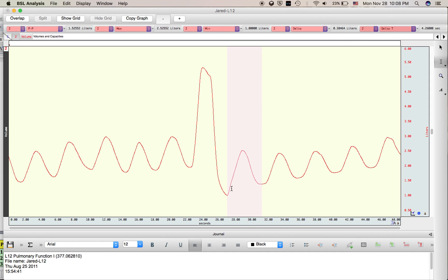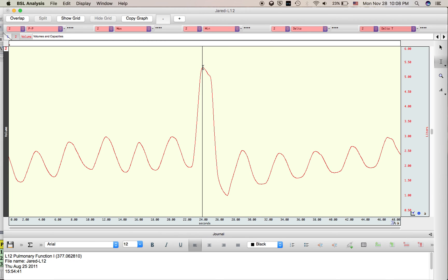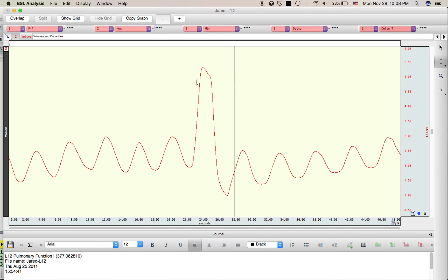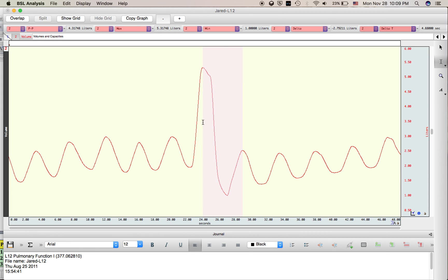Alternatively, I could go backwards from this tidal exhale to the deepest exhale, or take my deepest inhale and go to the following breath as well. Either of these delta values will give you the IRV or the ERV, respectively.